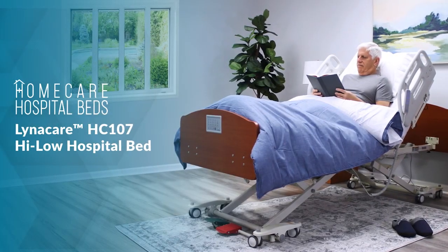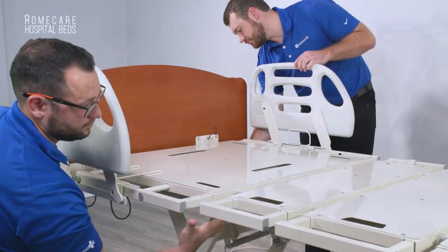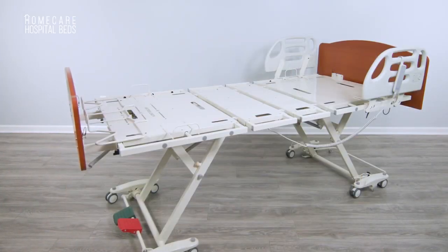Welcome and thank you for choosing the Lynacare HC-107 Hi-Low Hospital Bed. This video will demonstrate how to assemble the HC-107 from out of the box to fully assembled and ready to use.